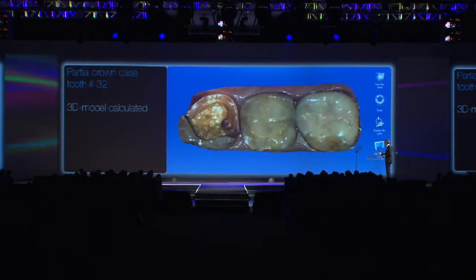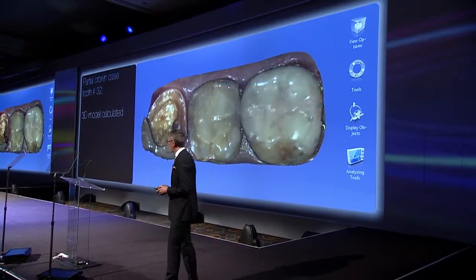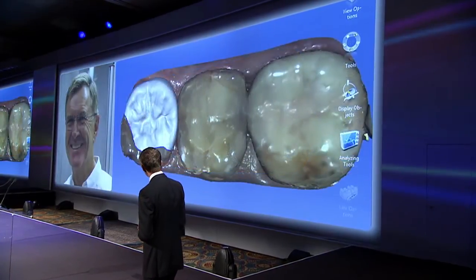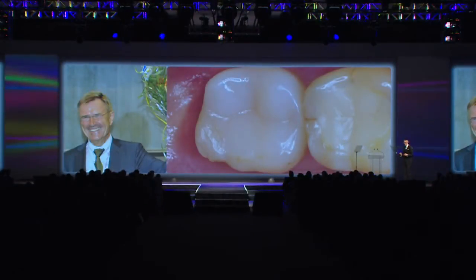Second case, last molar here. With BlueCam, it is sometimes difficult to access this area. With the OmniCam, no problem. So I have the preparation here, and we have a very famous patient for this cavity. This is Werner Mörmann, and I did this restoration some weeks ago. You see the proposal here, and then I did the machining, and here at this point some greetings from Werner to all of you. And in this case I used the Lava Ultimate, the composite block material.